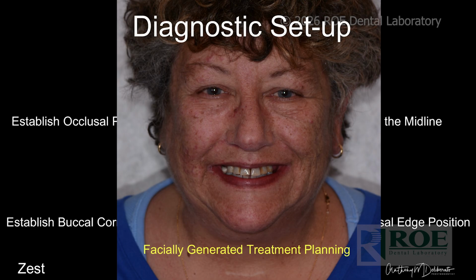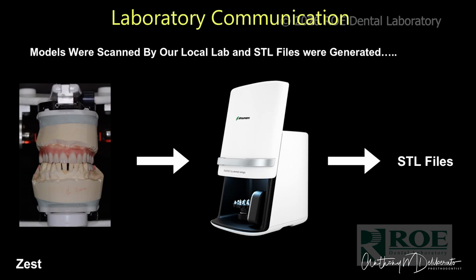And so we do this maxillary setup so that I can give the lab all the information they need to work the case up. I'm giving them the occlusal plane, the buccal corridors, the midline, the incisal edge position, and I'm sitting at my desk with a picture of her in front of me so I know where I want to put those teeth. You don't have to do the setup. You can send the lab a picture, and if you have somebody you trust, they can do the setup for you also.